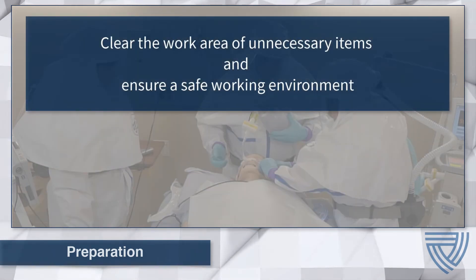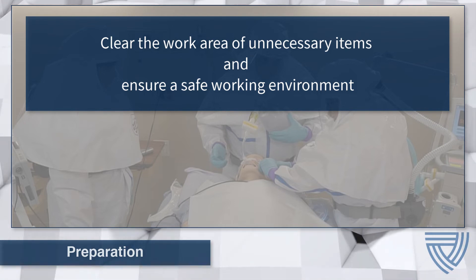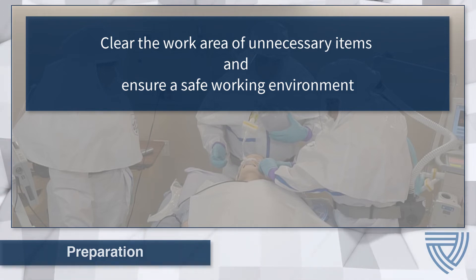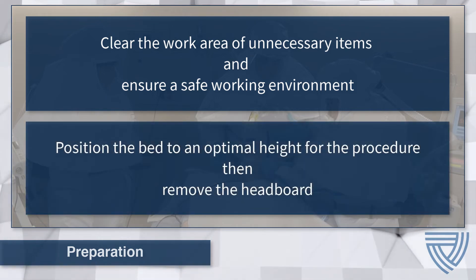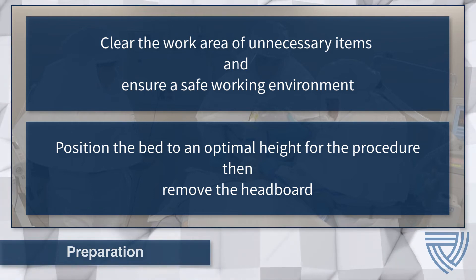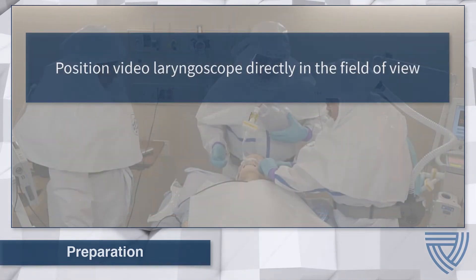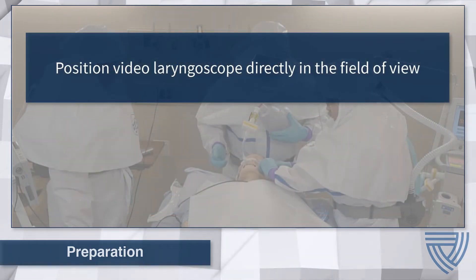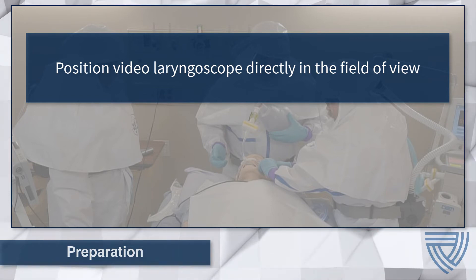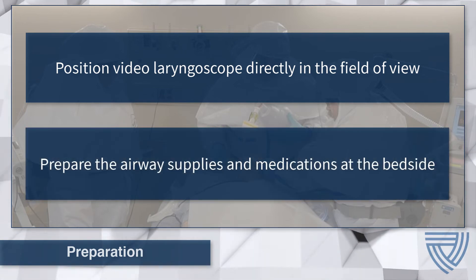To prepare the patient care room for the intubation procedure: clear the work area of all unnecessary items and ensure a safe working environment. Position the bed at a safe and comfortable height for the provider performing the intubation procedure. Remove the headboard. Prepare the video laryngoscope for use and position it directly in the provider's field of view.